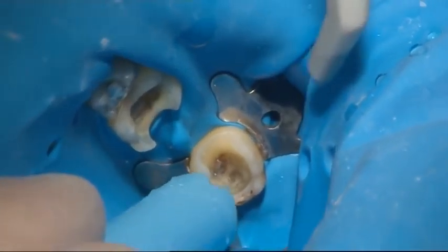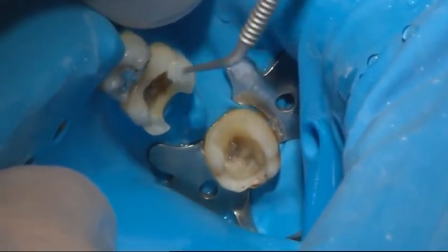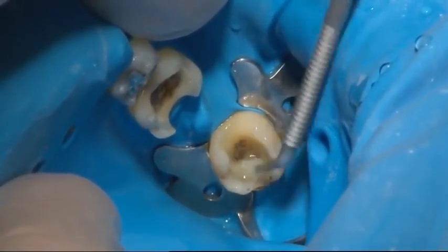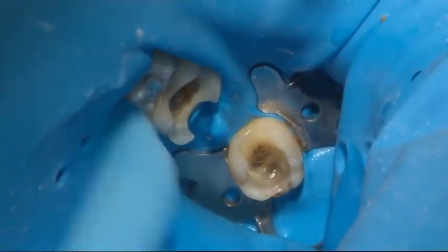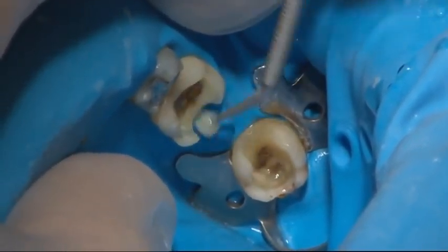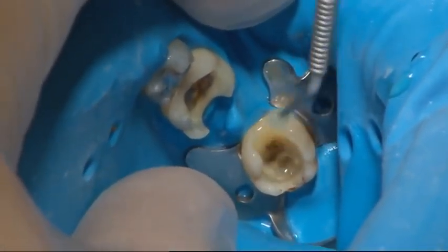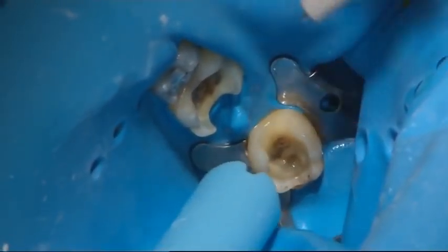The working area was kept dry during bonding and layering of composite. Use of a rubber dam is highly recommended. The teeth surfaces were bonded using separate primer and adhesive according to the bonding agent manufacturer's instructions. The bonding agent was light cured as described by the manufacturer.